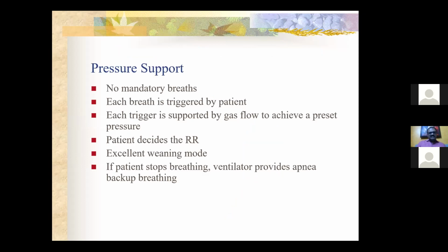Then the other one is the pressure support mode. It's almost the non-invasive type of what we discussed. Only thing here is the patient is on a tube. It's an invasive type of NIV, we can say. There are no mandatory breaths.